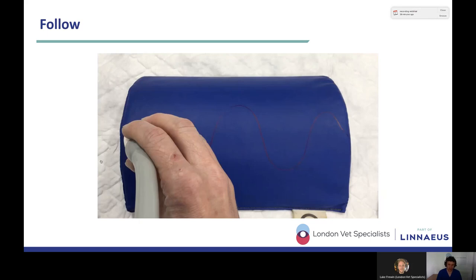and to try and demonstrate a differential between the small intestine orad to a potential obstruction versus aborad to the obstruction. And if a patient does have a mechanical illness, if they are obstructed, then the orad intestine will be larger than the aborad intestine. So the intestine towards the mouth relative to the foreign body will be really big and full of fluid and gas, and the intestine more towards the colon will be empty.